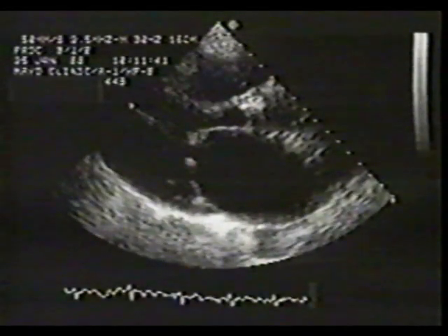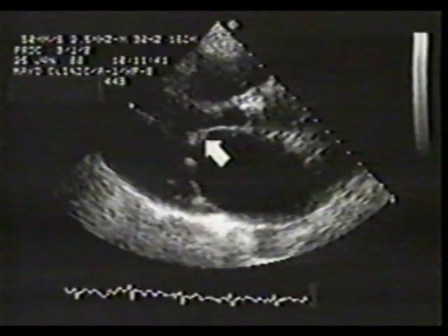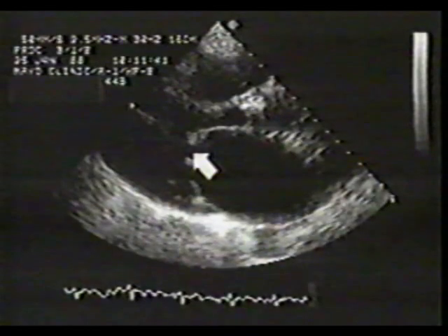This is yet another patient with mitral stenosis. The left atrium is enlarged. The mitral leaflets are thickened, and the diastolic opening is reduced.